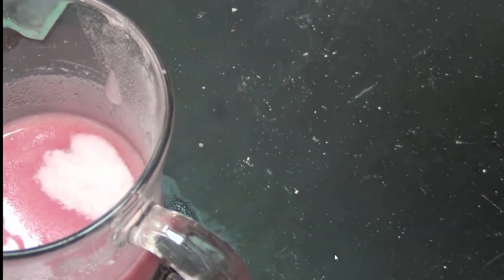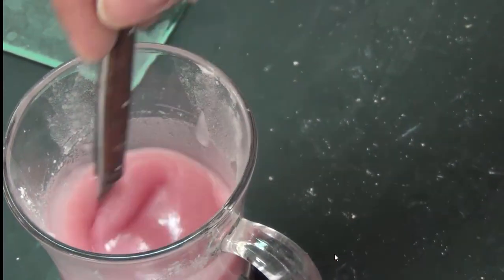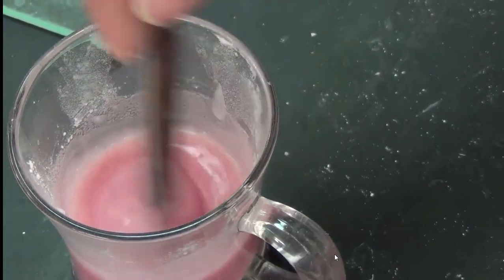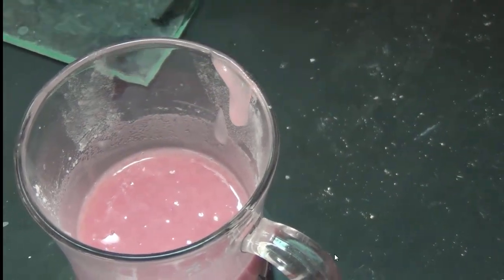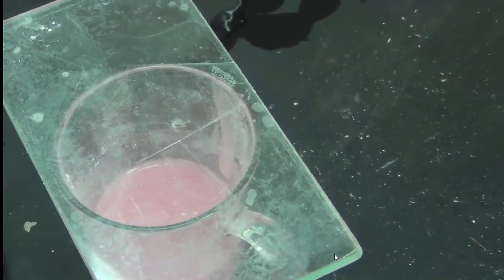Okay? See, look at this powder. It's slowly soaking. That means it's not taking a lot of monomer. This is when I stop adding powder. Now I can mix thoroughly. So, mix it thoroughly, making sure that all layers are incorporated. And then immediately we cover it, waiting for the setting stages of the material. We cover it with a glass slab. Why? Because we want to make sure that the monomer is not evaporating.